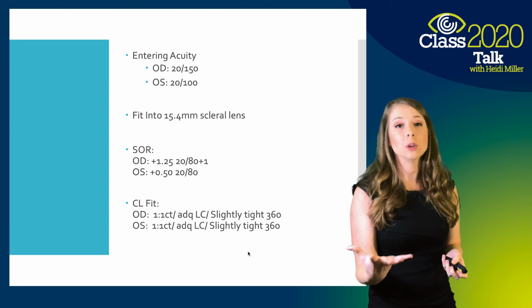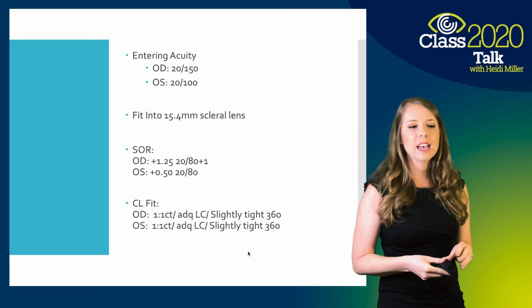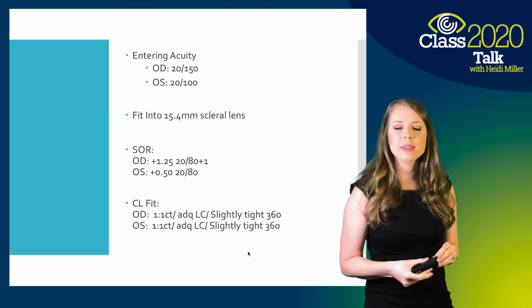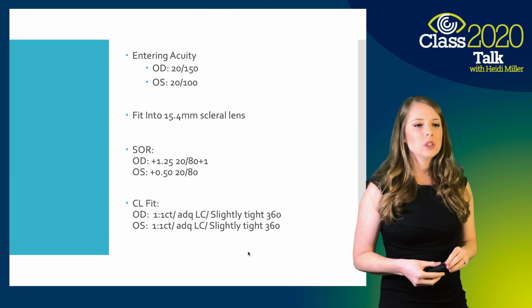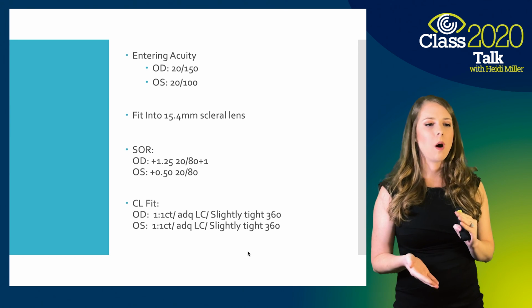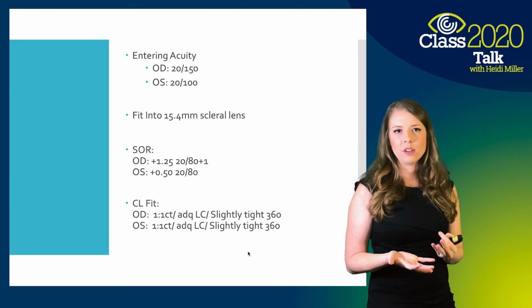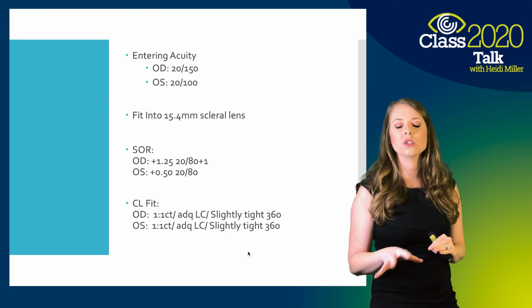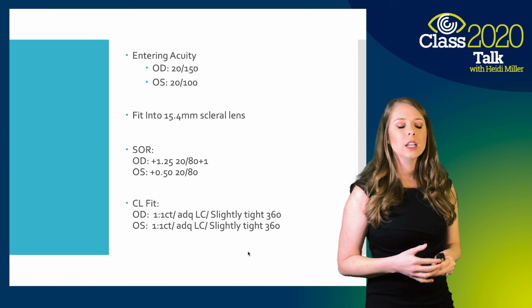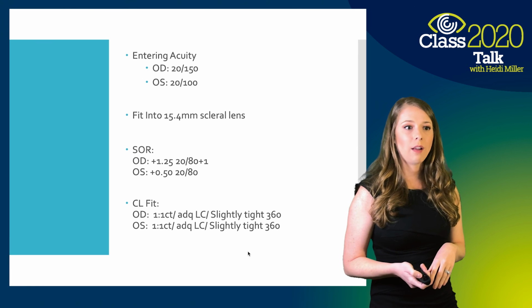She could hardly keep her eyes open even to do the visual acuity. The fit itself was looking okay, but the edges were a little bit tight. So throughout the process of the follow-ups, the main thing that was being changed was changing the OR as needed based off of whether the vision was changing, and then also making sure that edge alignment was a little bit better. She ended up with toric peripheral curves and then made modifications based on the follow-up visits.